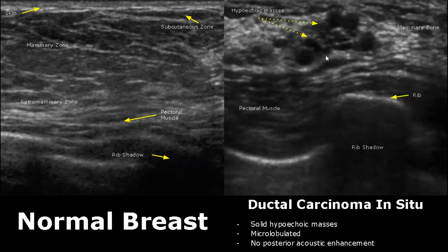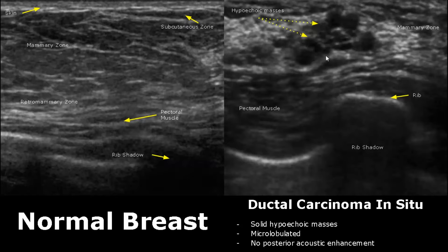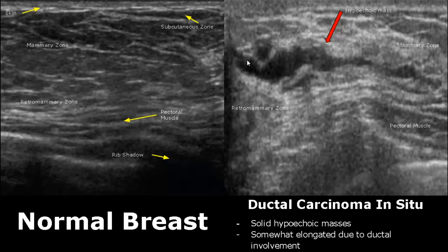Ductal carcinoma in situ will have hypoechoic masses which will be microlobulated, meaning they have outpouchings, and there is no posterior enhancement, indicating a solid mass. In another image, the mass involves the ducts so it appears elongated. Usually these hypoechoic masses involving the duct are ductal carcinoma in situ.